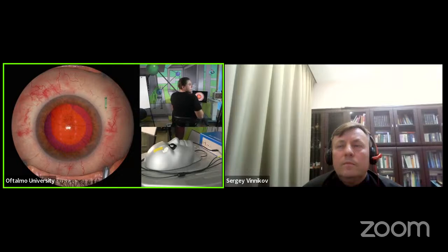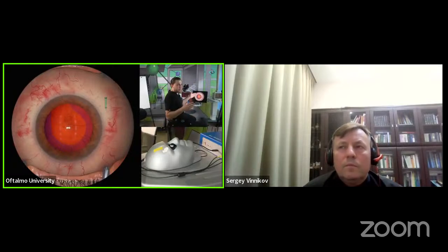So basically what we did here is we prevented it from going towards the periphery and going way around the posterior capsule, for example. So this is a pretty basic rescue maneuver in which we had a rhexis with very high tension. As you could see before, I didn't put that much visco, to simulate that if you press along the incision floor, the visco is going to come out and the capsulorhexis tear is going to go towards the periphery.